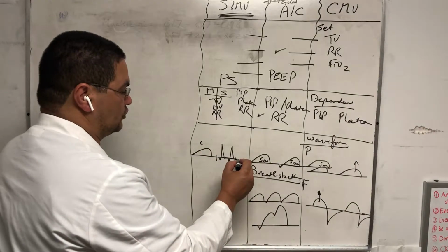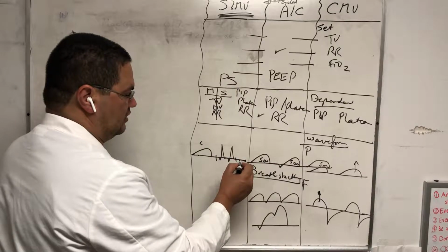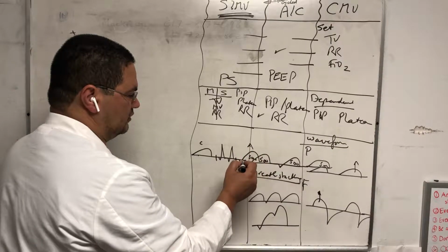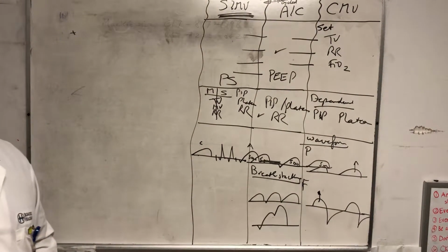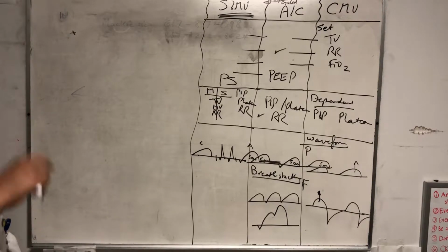And then the third portion, it's very close now to the next breath here. So the third portion, if you take a breath here, the machine will give you a full machine assisted breath, 500 tidal volume, right? But then it resets the timer, so you don't have breath stacking. So that resolved the whole idea. That's why they call it synchronized, intermittent, mandatory ventilation.